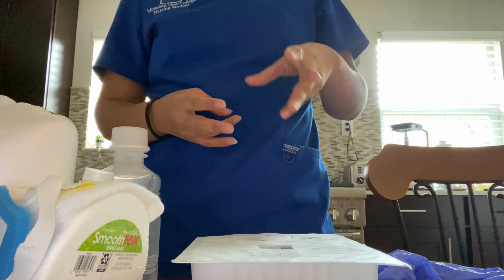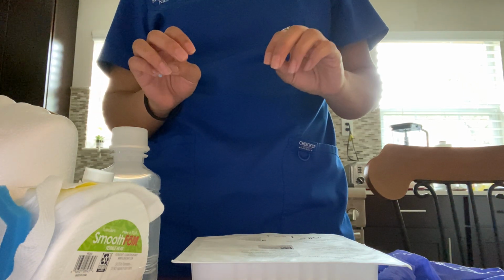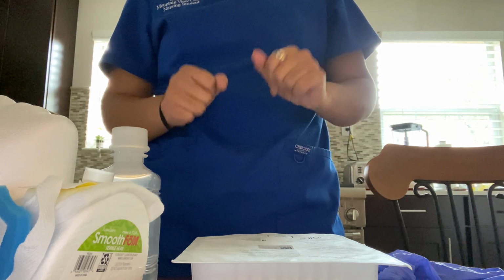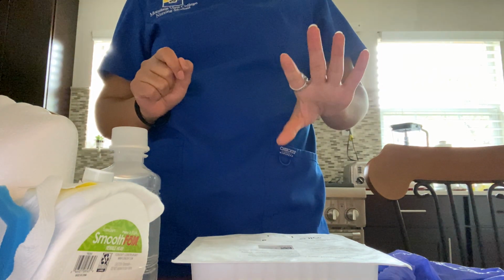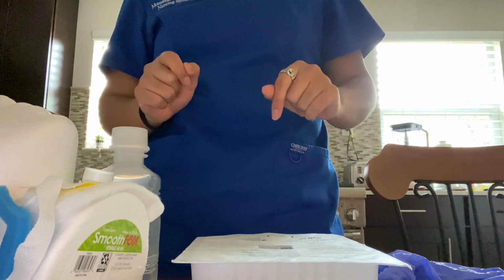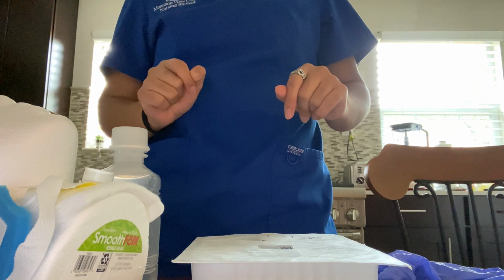Then you're going to remove the trach suction kit. Make sure it does not touch anything, because you want it sterile. Okay, so you're going to have one sterile hand. Mine will be my right hand, and my dirty hand will be my left.